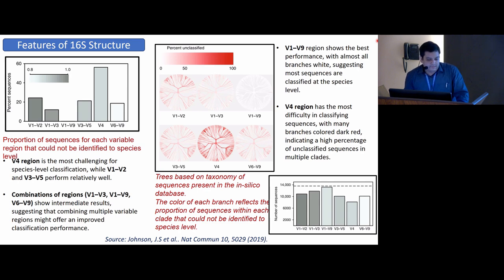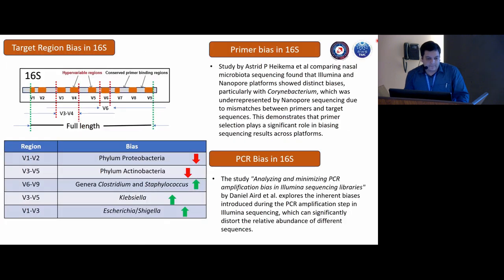So it is advantageous in a situation where the patient is going through graft versus host disease, or patients are dying of sepsis. You need to know exactly what species is causing it, and suppose there is an outbreak, you need to have a specification of what the outbreak is. And the V4 regions, you can see some inferences that it is highly unreliable, with very few mismatches. So you don't target V4, you target V1 to V9. That's the lesson: you target V1 to V9 to get better coverage.